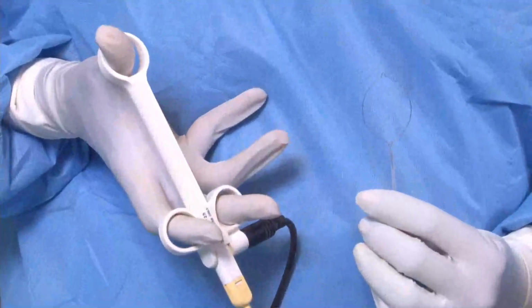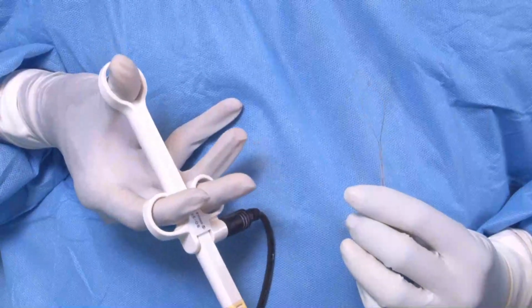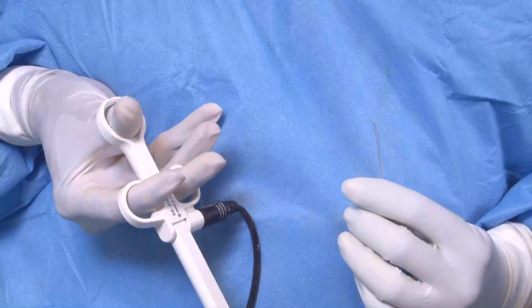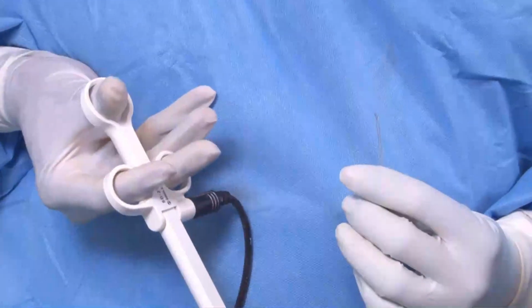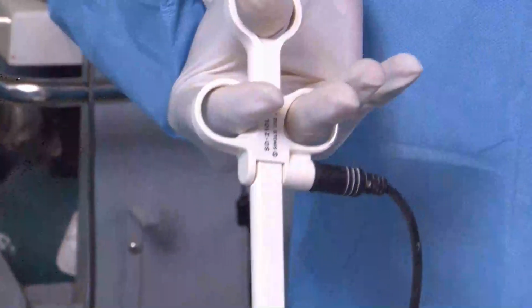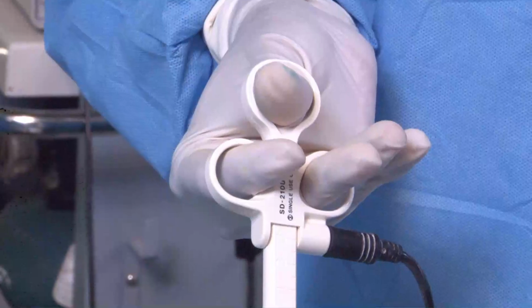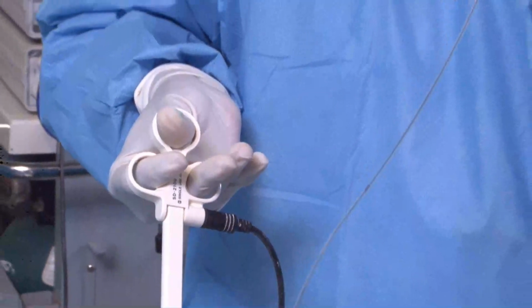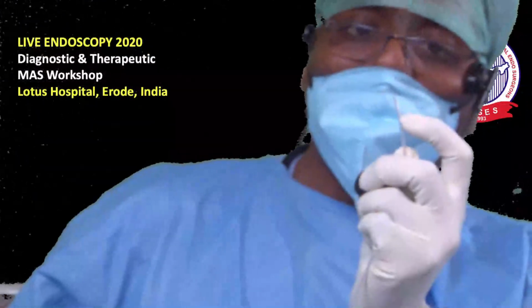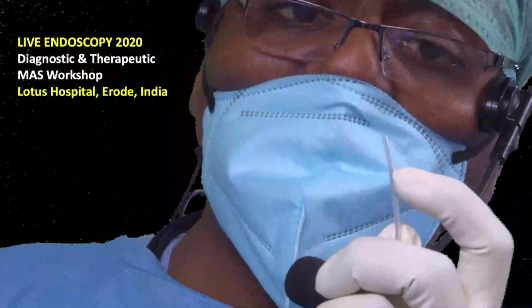Now it is open. Now I am just going to close, close, close. When it stopped going, see, it has completely gone in. That time I have to put a little mark here on the handle, because if I go a little further, see, another 1 centimeter I go. Can you watch? Because the thing has gone up to here. So between the place where it is exiting and the place where it is settling, there is a difference of a centimeter.